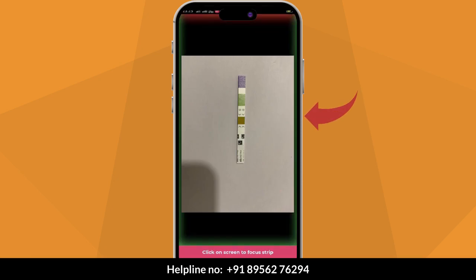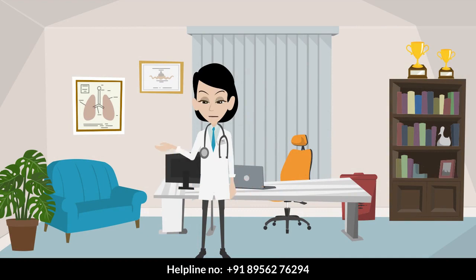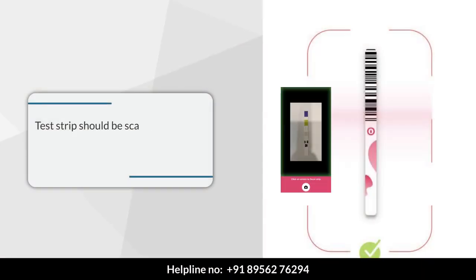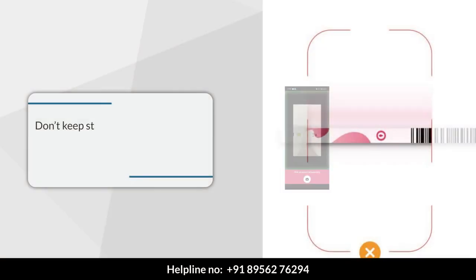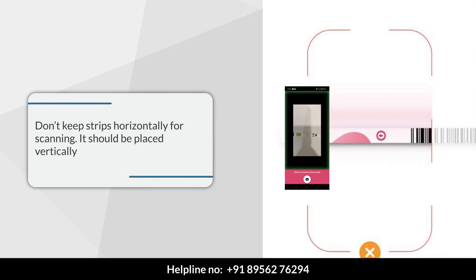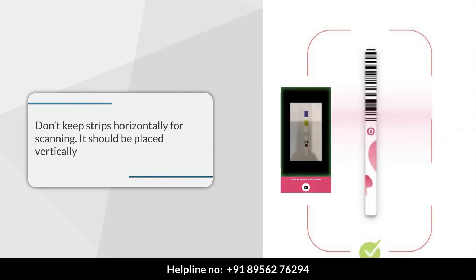If any side shows red color, move the camera accordingly. Once all sides are green, click the image of the strip. The test strip should be scanned by keeping the complete strip vertically aligned in the bounding box. Do not keep strips horizontally for scanning — it should be placed vertically.